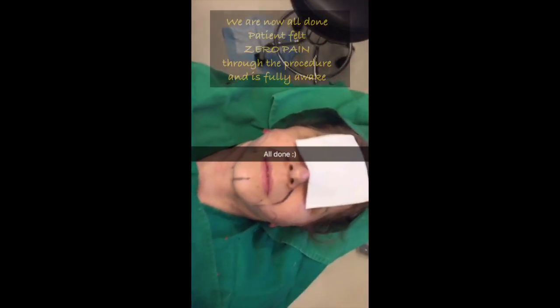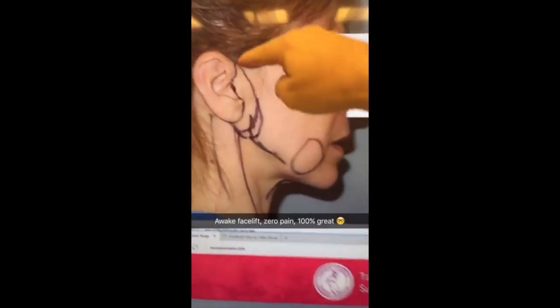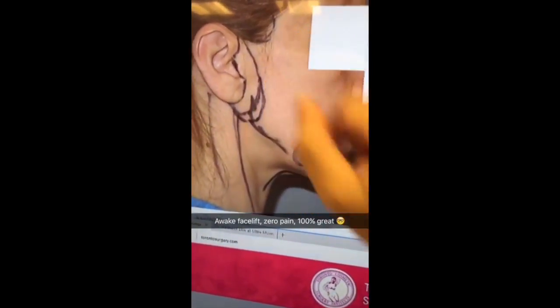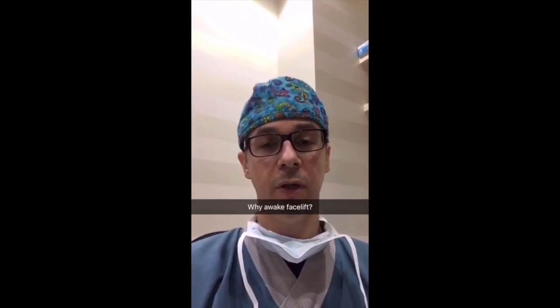How are you feeling? Excellent. Okay, all done. You look awesome. So we did this facelift on local anesthesia. I made an incision along the ear, undermined the skin, did a little liposuction, pulled the skin back and fixed the muscle. We just finished doing the facelift on a patient who was awake throughout the entire procedure and we got a lot of questions.